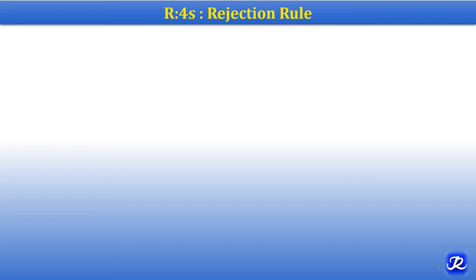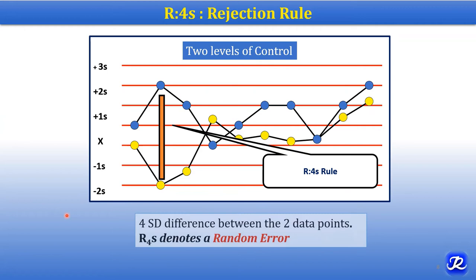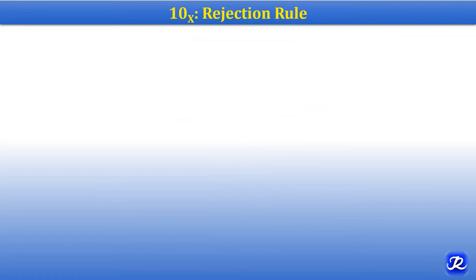The R4S rule is applicable when two levels of control are used. In this condition, there is a four standard deviation difference between two data points. For example, in level 1 control I get a data point here, and in level 2 control I get a data point there, and there is a difference of four standard deviations between the data points of both levels. This is the R4S rule, which denotes random error and is a rejection rule.